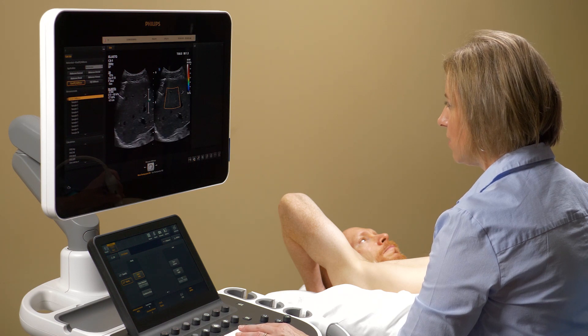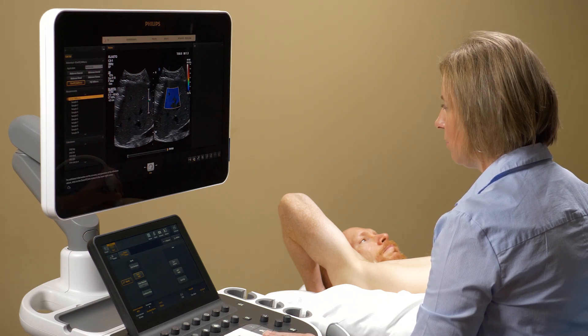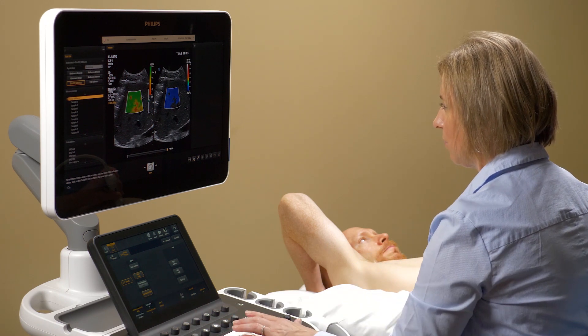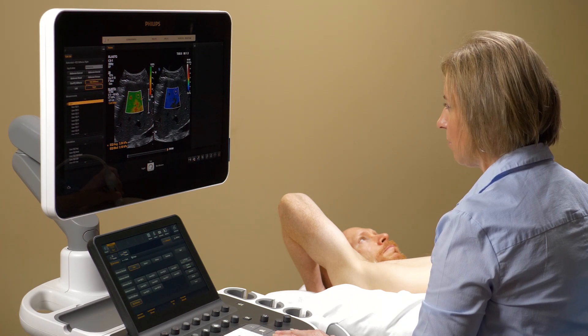For effective use of EQI, Philips developed a robust protocol including patient preparation, acquisition advice, sampling strategy, and interpretation guidance. This protocol reflects feedback from expert users and worldwide guidelines.